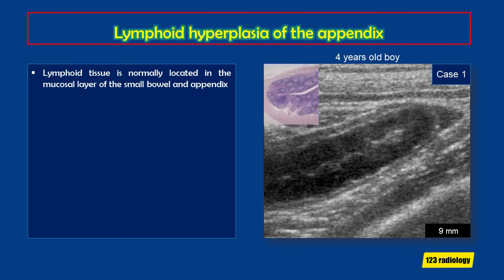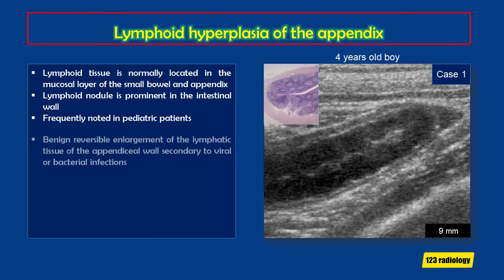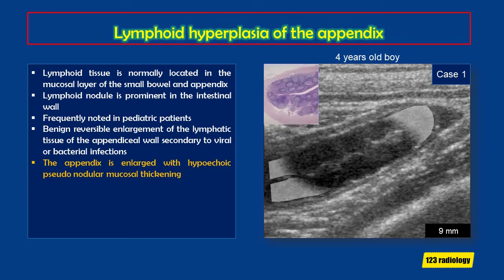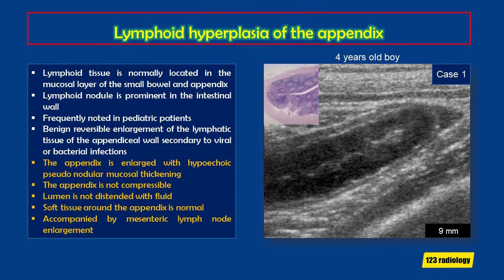Intestinal lymphoid tissue is normally located in the mucosal layer of the small bowel and appendix, appearing as lymphoid nodules or lymphoid infiltrate. When prominent, it is referred to as intestinal lymphoid hyperplasia. This is frequently noted in pediatric patients and represents a benign reversible enlargement of the lymphatic tissue, secondary to viral or bacterial infections. On sonography, the appendix is enlarged with hypoechoic pseudonodular mucosal thickening representing enlarged lymphoid follicles. The appendix is non-compressible but the lumen is not distended, the surrounding soft tissues are normal, and mesenteric lymph node enlargement is often present.